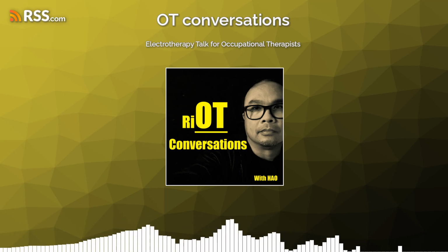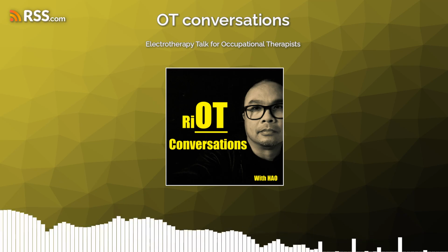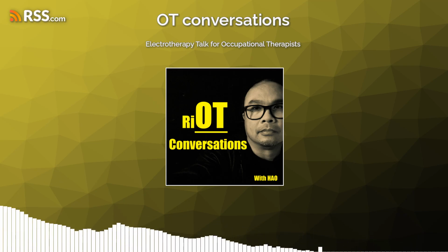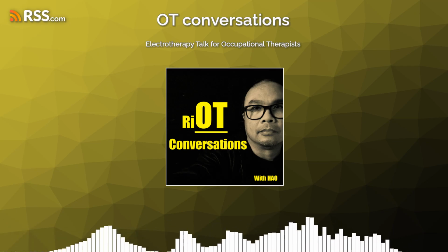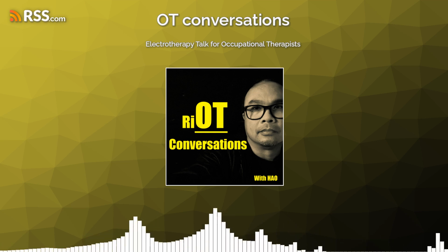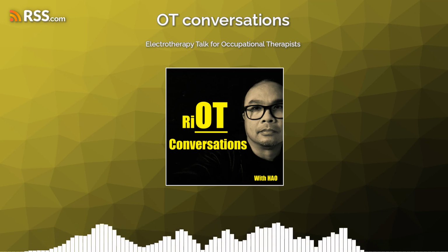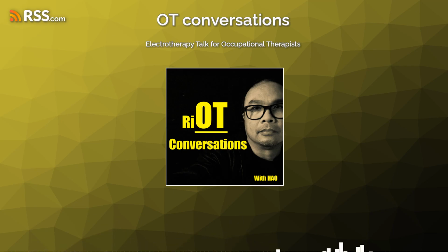In this episode, I'd like us to have a discussion about some of the treatments and some of the interventions that we are allowed to do as occupational therapists. This treatment is called electrotherapy. So, what is this? This is the use of electrical energy as a medical treatment to stimulate the nerves, the muscles and the tissues. It is commonly applied in rehabilitation, particularly for pain management.